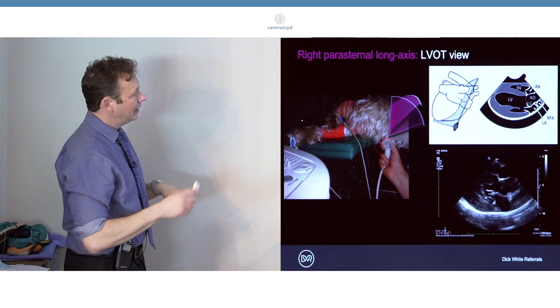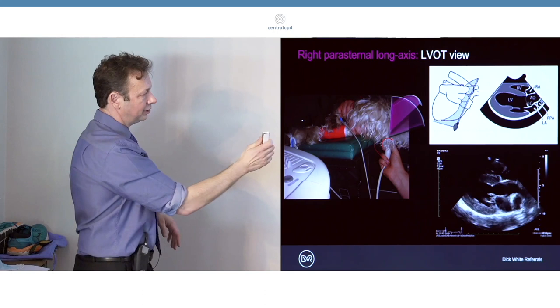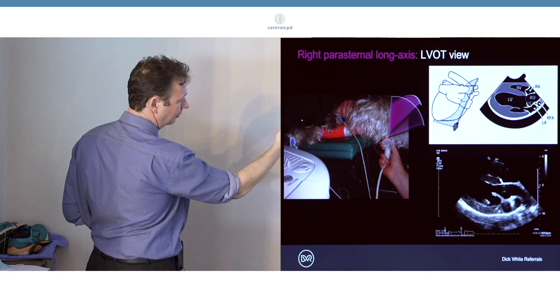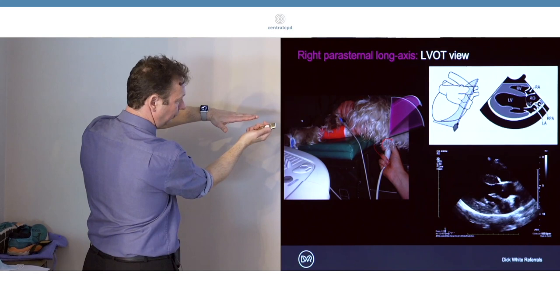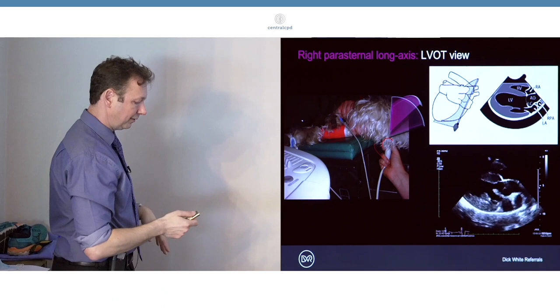If we then turn the probe a little bit clockwise - and it's not a large movement, it's usually about 30 degrees - what we also tend to need to do is to drop our hand round up towards the patient and often to slide forward a little bit.